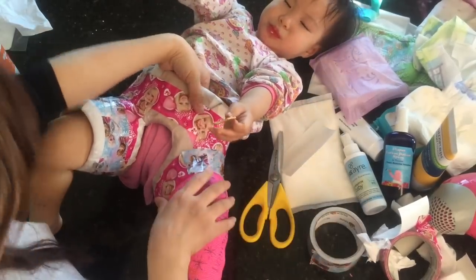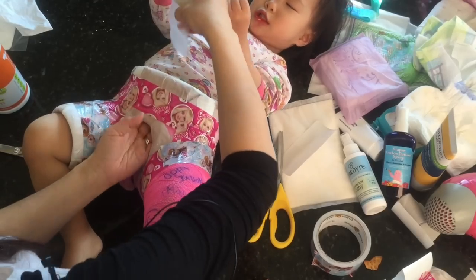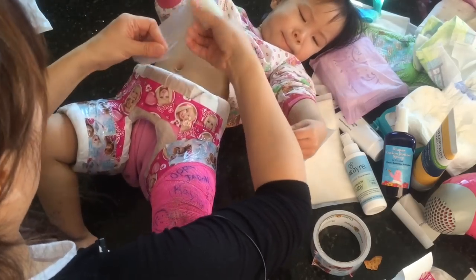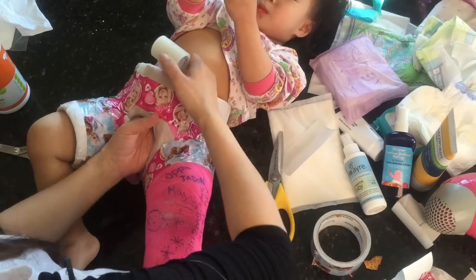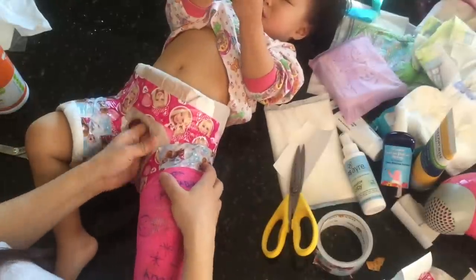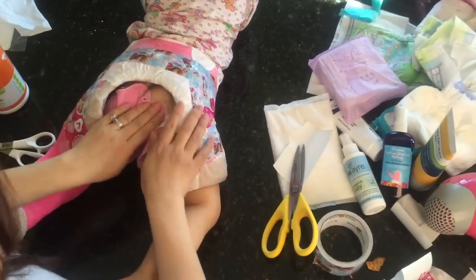It's so important to have the cast dry because if there's a wet spot that's when they start getting rash all over their skin. You have to make sure you have a dry cast. This is one of the most effective ways to do it. When I took her to get the spica cast checked, the technicians were so amazed — how did you do this? I want to share this because it saves so much headache from a leaky spica cast. Look how nice it is, all sealed up.